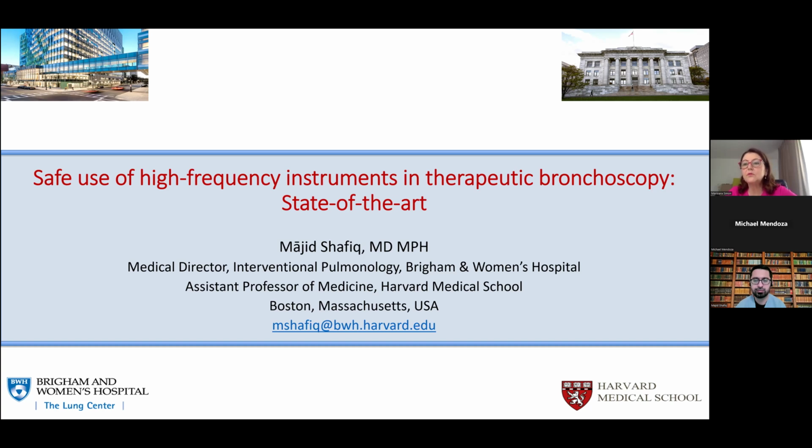If you have a tumor that obstructs the bronchus, and you can't use the electrocautery snare to take off the tumor, what do you perform? Electrocautery, marginal electrocautery, or rigid biopsy forceps? What do you do in this situation? Because a lot of the time I have this problem. The tumor has a large implantation base, and it's impossible to extract with a snare.